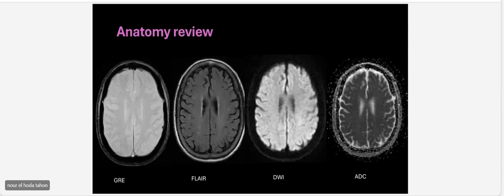You can say this may be a demyelinating disease, multiple sclerosis, especially if you find it periventricular, in arrangements perpendicular to the corpus callosum. So actually this differs in the clinical setting. Every patient has a different history and different age, but most of the time we call this microvascular changes.